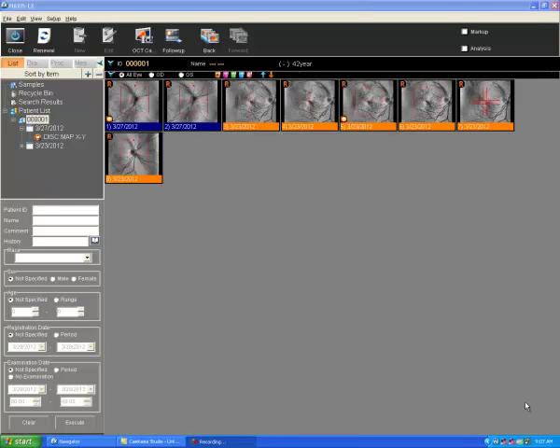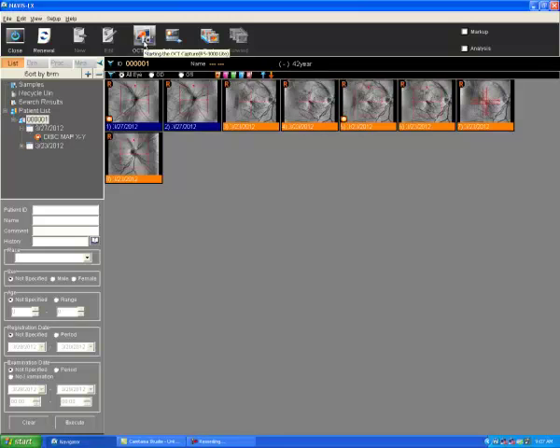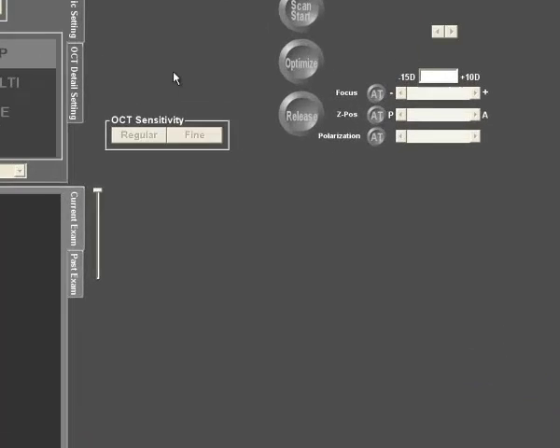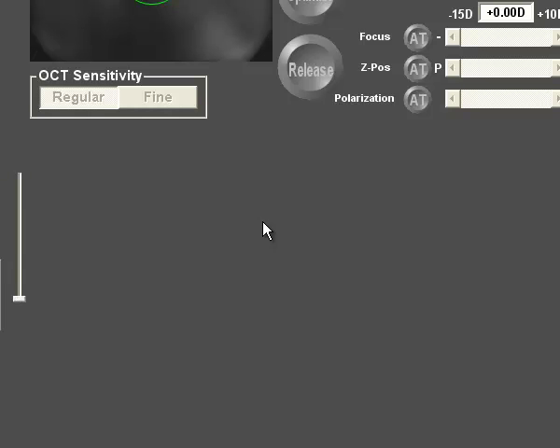Welcome to the DFV troubleshooting page on how to set combination scans for your RS3000 OCT. To get into the combo settings, first you need to get into the capture screen. Just hit OCT capture. The system will then start up and you should hear the actual headset start to move around.